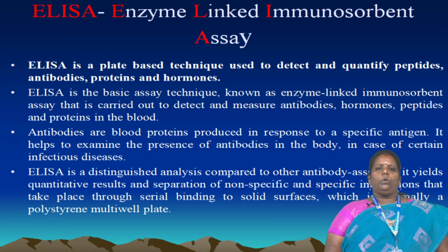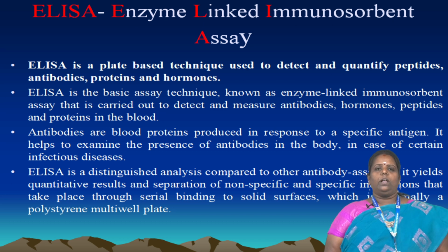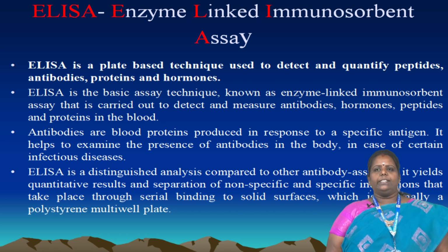First, we look at what is meant by ELISA, what the uses of ELISA are, why we have to know about it, and what its applications are. ELISA is the short abbreviation for enzyme linked immunosorbent assay. Why is the enzyme important? Our body has a lot of enzymes.